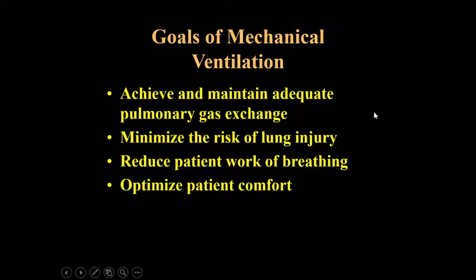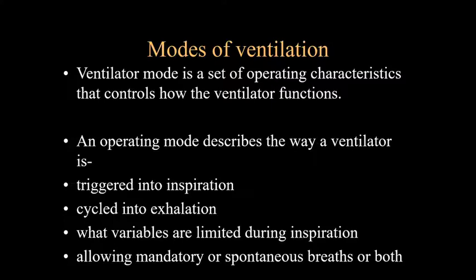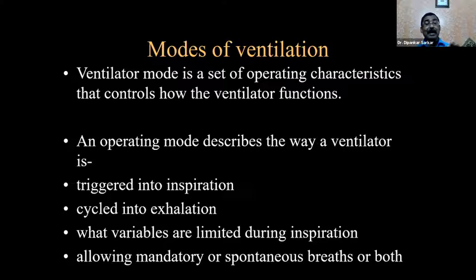Now, the modes of ventilation. While I'll be showing you the ventilators, I'll be talking about the modes of ventilation. The definition of a mode of ventilation is a set of operating characteristics that controls how the ventilator will function. That means how it will be triggered, how it will be cycled, and how it will be limited. So that makes the mode of ventilation.